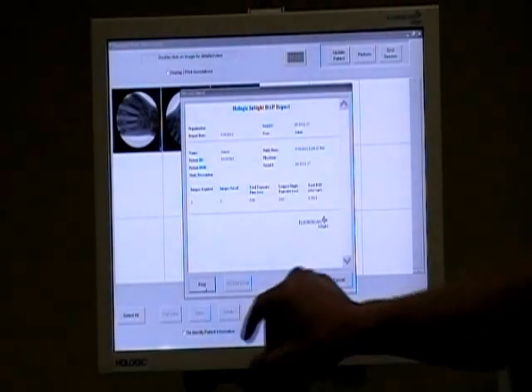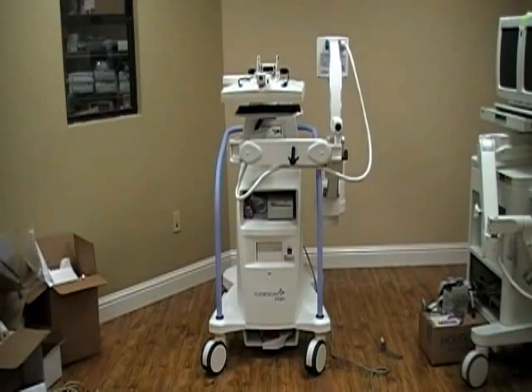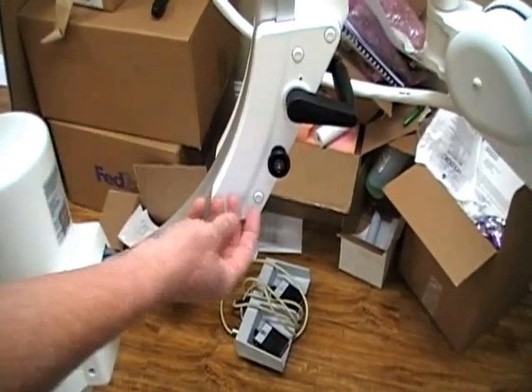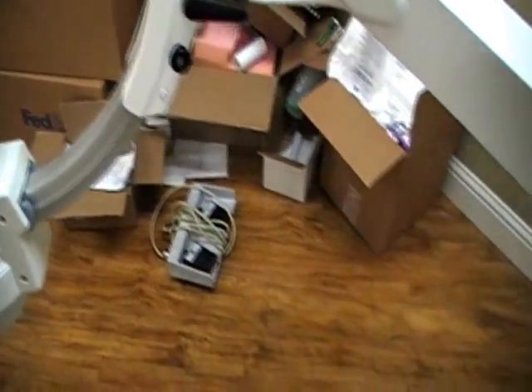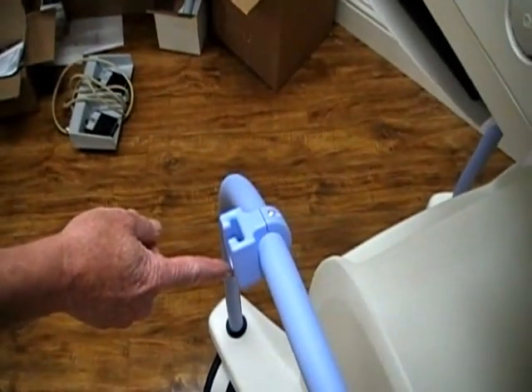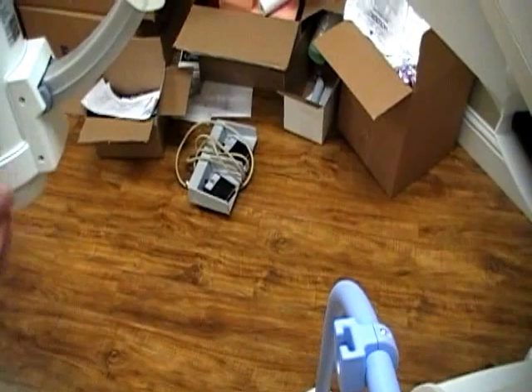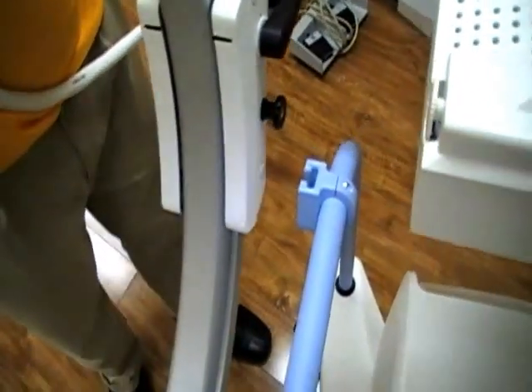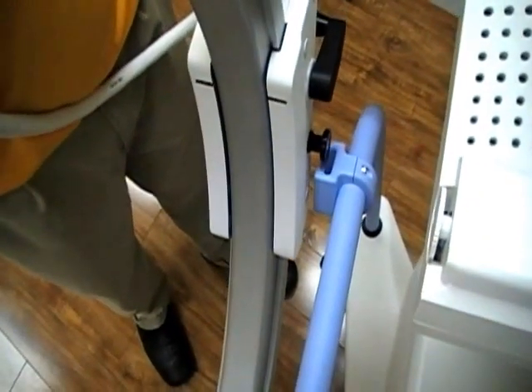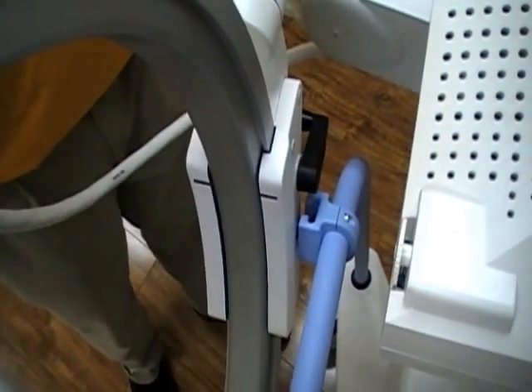We can also send the DAP report to the PACS system by hitting DICOM Send if we're connected. This is what the system should look like when it's properly stored. On the C-arm there's a handle that fits inside a receiver. The handle is like a T — if you put it in crooked it won't go easily. Bring the arm around, line up the handle with the receiver, push down on the arm, it goes in, lock the C-arm, and you're good to go.